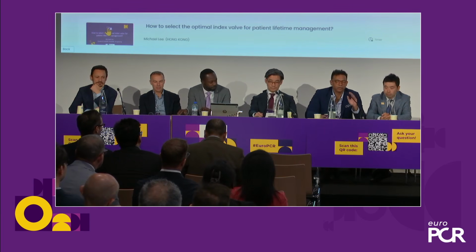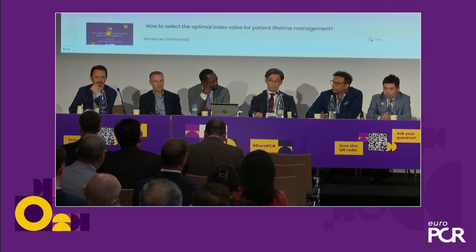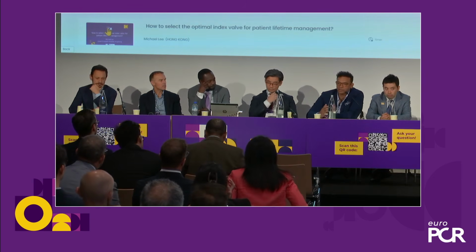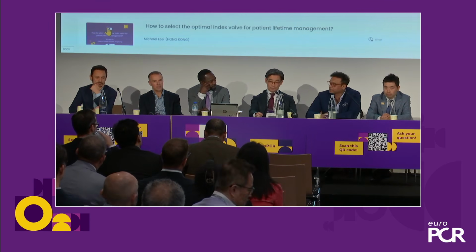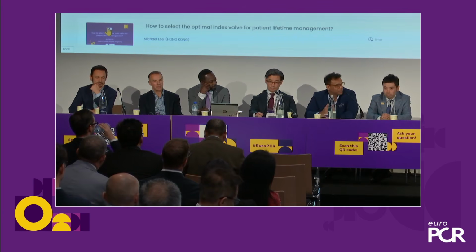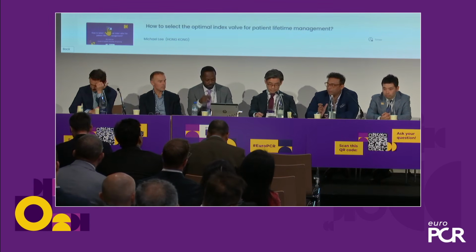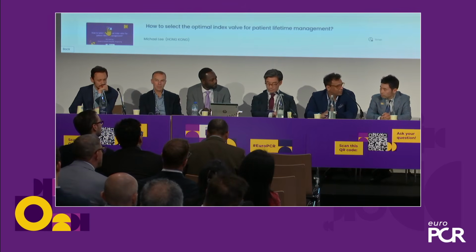Look, I agree that one should never jeopardize the primary index procedure for the sake of a potential future procedure which may or may not be needed, and if needed, we don't know how things are going to be in 10 years' time. We might be excising leaflets or splitting them and using dedicated devices. One question I did have was that since you measure membranous septum lengths, and if you have a young patient where you have the safety margin of a long membranous septum, would you then err on the side of going lower, or not really?